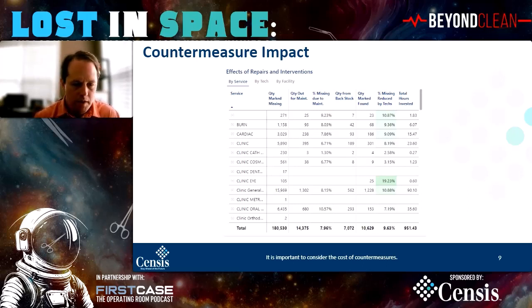And one knife handle isn't that expensive, but this is a problem that happens all day, every day with thousands and thousands of instruments. So in the aggregate, that's hugely impactful for the facility and ultimately for the patient, right? So one of the things you definitely want to do is measure that, be transparent about that, both with the technicians and with the OR.